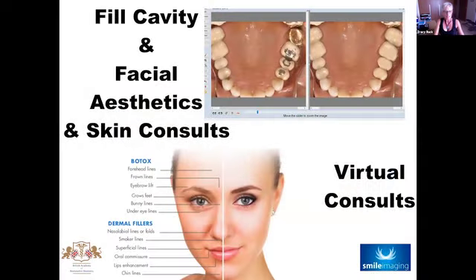Okay, so our next tool within our procedures is the fill cavity tool. As you can see here in our top photo, we've changed the amalgam restorations to white, more aesthetic, stronger replacements there. So if you've got intraoral cameras, this is a great way to show patients how their smile can be changed with the imaging there.